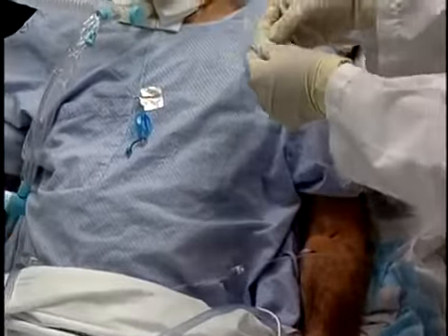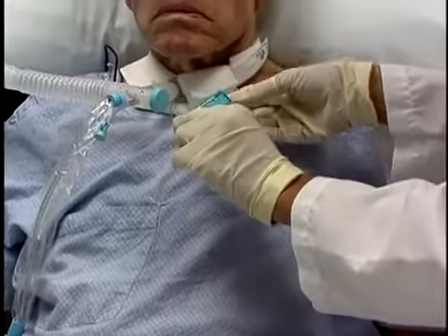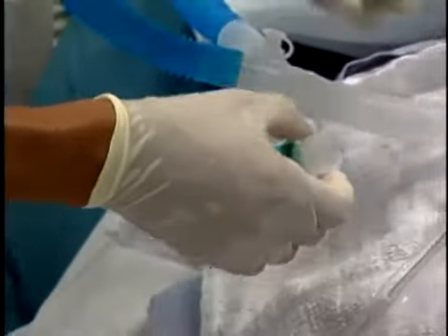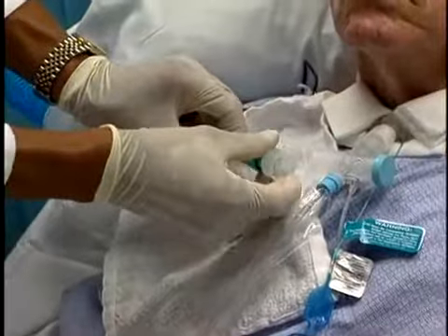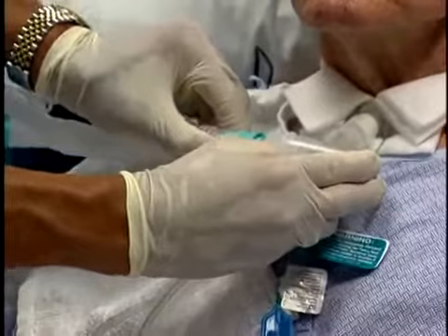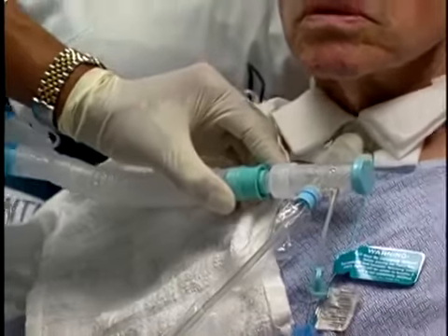All Passy-Muir speaking valves, with the exception of the PMV 2020, can be used in line during mechanical ventilation. The PMV 007 is designed to fit into disposable ventilator tubing and is most often the valve of choice for inline ventilator use. However, the PMV 005, PMV 2000, and PMV 2001 can also be used in line with non-disposable flexible rubber tubing. The valve does not need to be placed directly on the hub of the tracheostomy tube, but must remain as close to the tube as possible for optimal function.